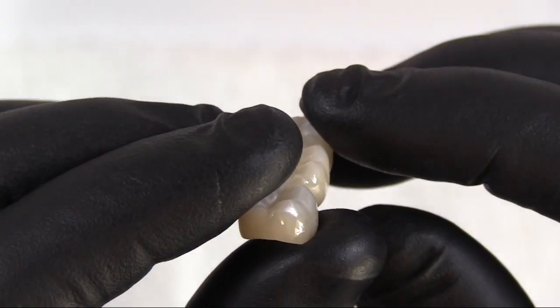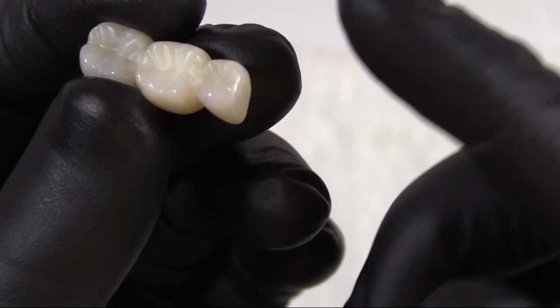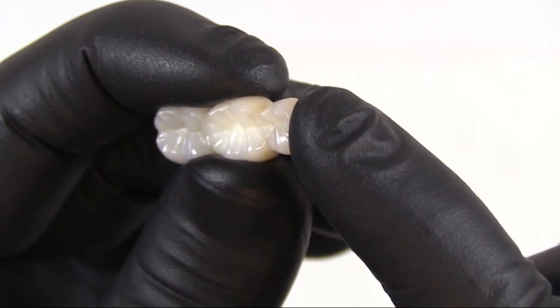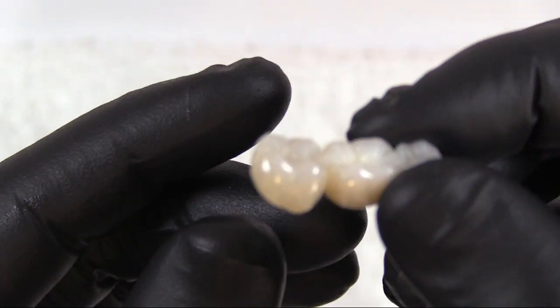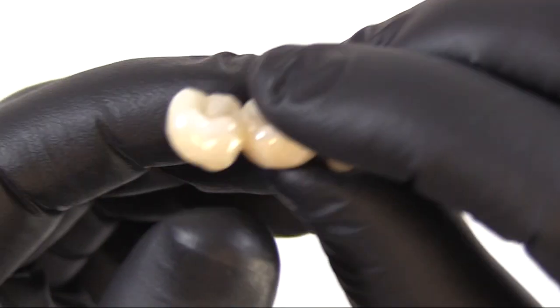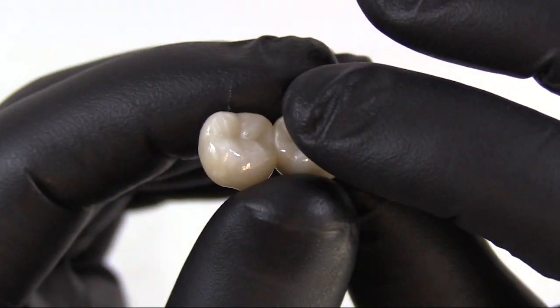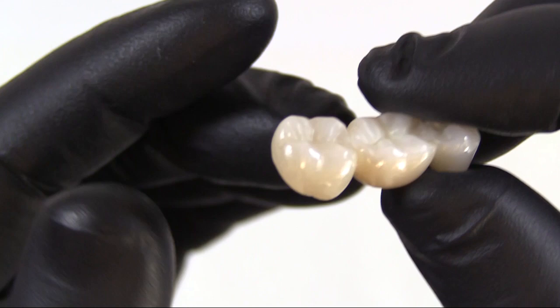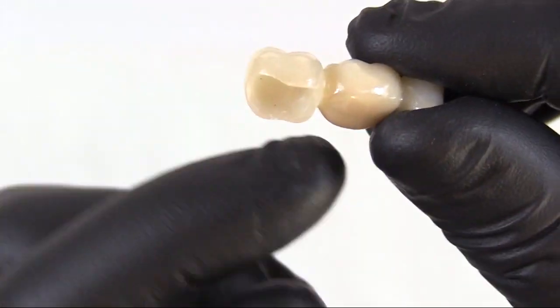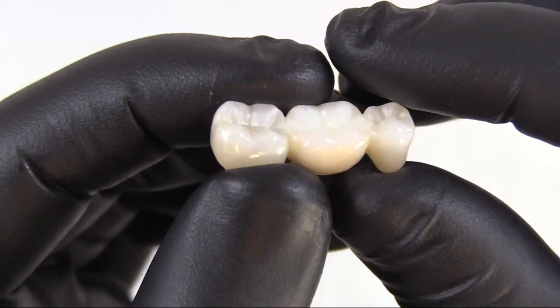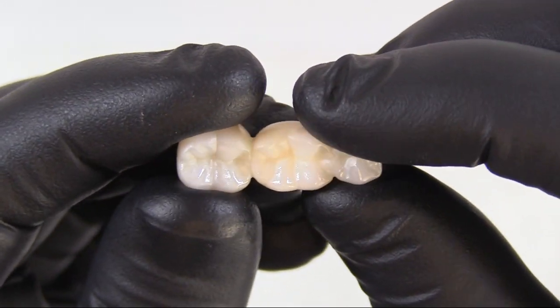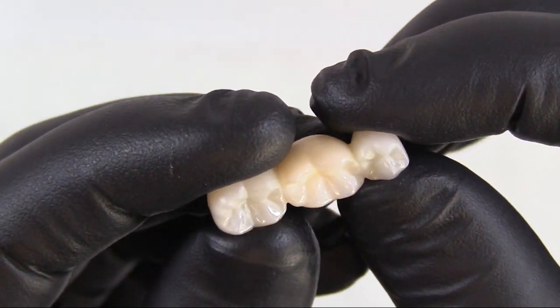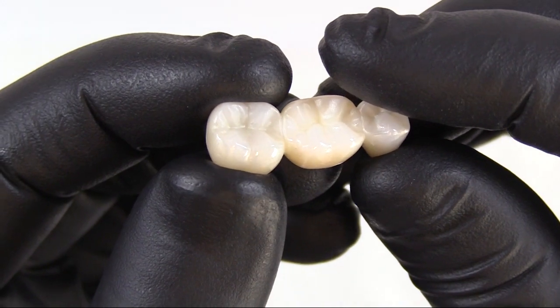We always want to check contacts. With a nice acufilm occlusion paper, we can mark the interproximals when we seat it intraorally and make sure we have nice interproximal contacts without any heaviness. If the contact is too heavy, it might impact the full seat, as can the ovate pontic if it's too heavy on the edentulous space.